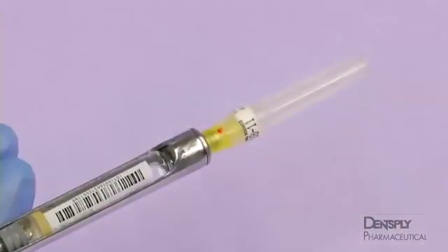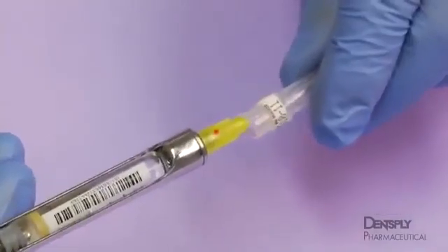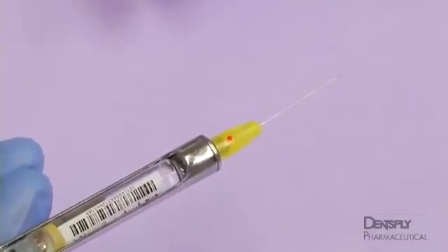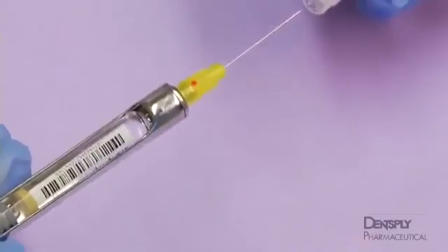Clinically, the 25-gauge long needle used for the injection can be bent 30 degrees at the hub to facilitate medial insertion. Because this action weakens the needle, the patient must be cautioned to remain still during injection, and the needle must be advanced gently through tissue.